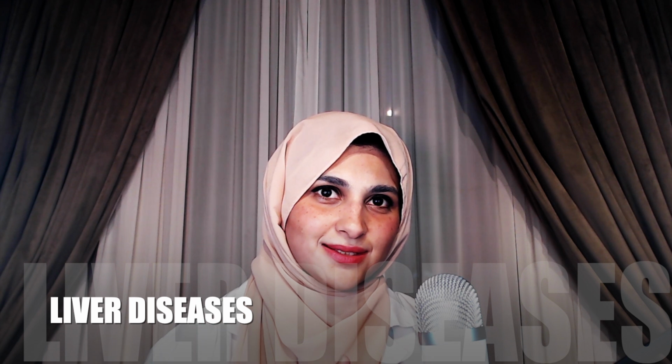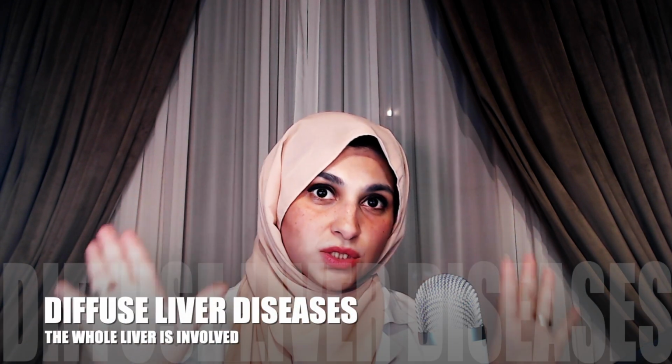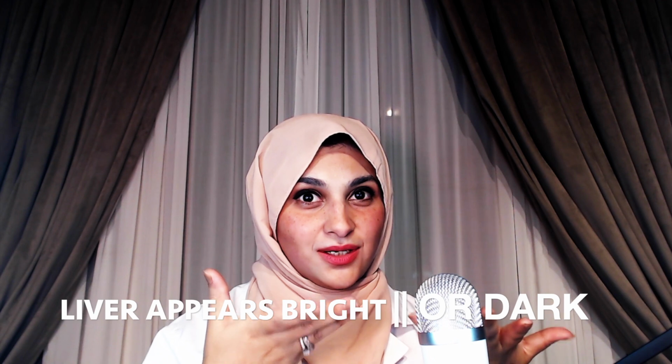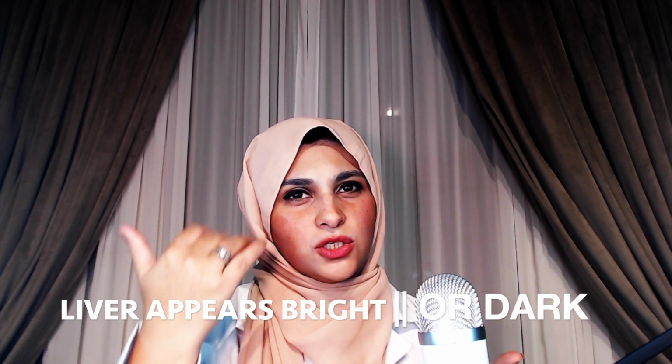Liver diseases. Now, trying to make things simpler, the liver diseases can be divided into diffuse liver diseases, in which the whole liver can be seen affected with the help of ultrasound. And this further can be divided into the liver diseases in which the liver will appear brighter, and the liver diseases in which the liver will appear darker.